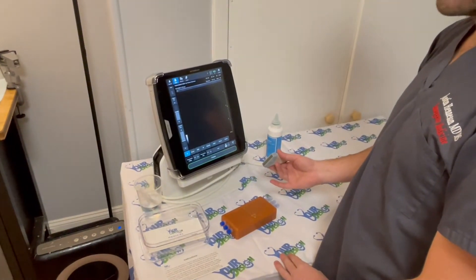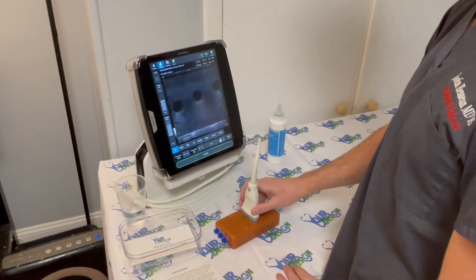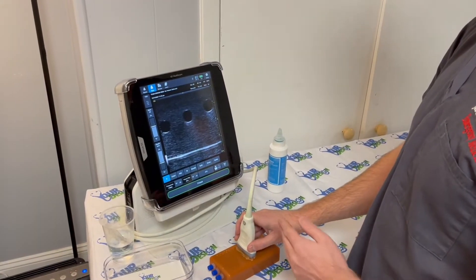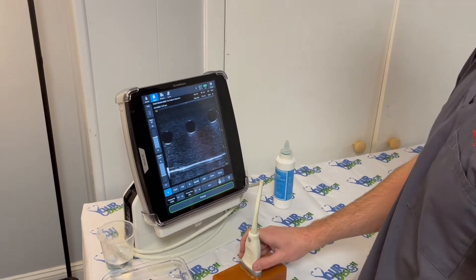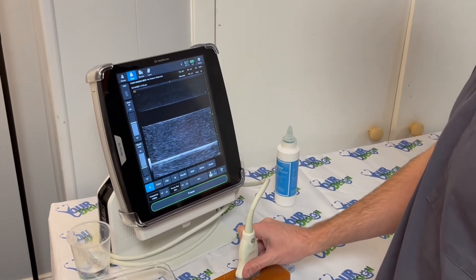Once you've filled all three vessels with fluid, take a linear ultrasound probe and place it on the phantom. Set your gain such that you have a light gray background and the vessels are clearly visible in both short axis and long axis.